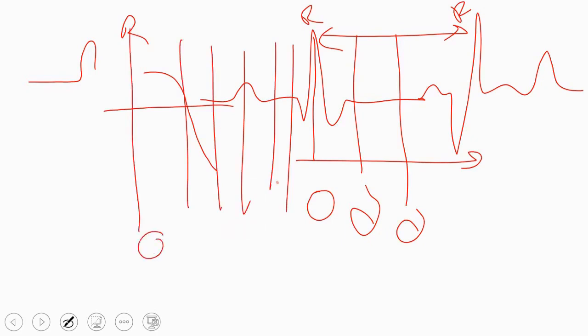So what do I have at each R? For example, this examination lasts 5 minutes. And in those 5 minutes, there are 100 R. So how many images of R do I have in this situation, in this movement of the heart? I have 100 images, right?